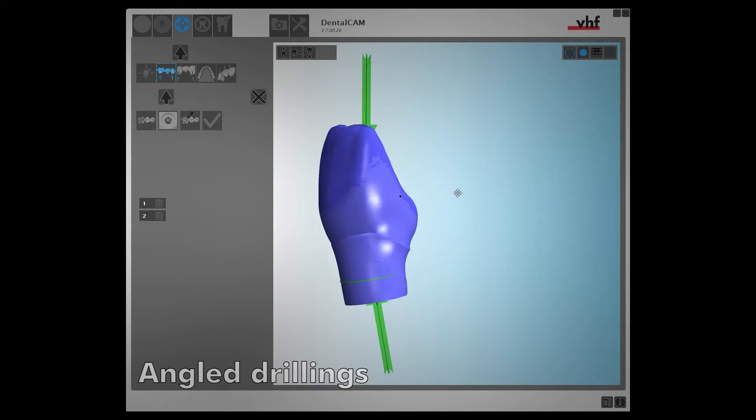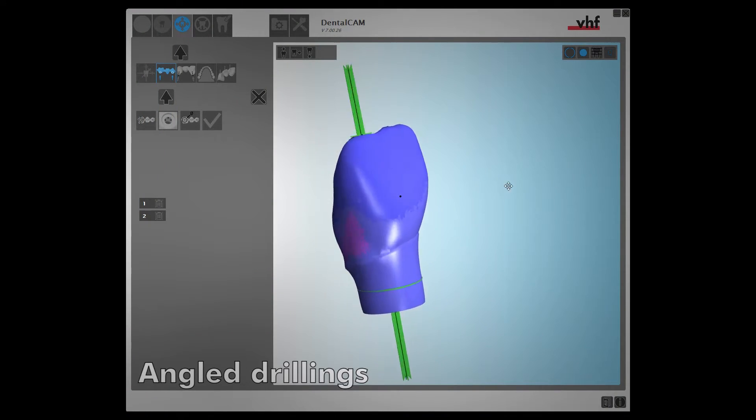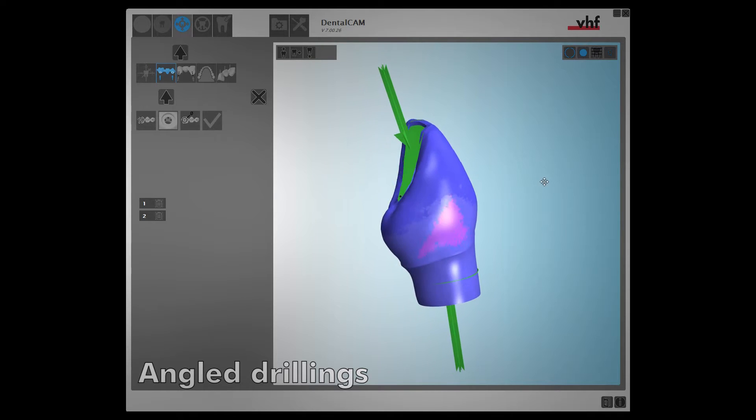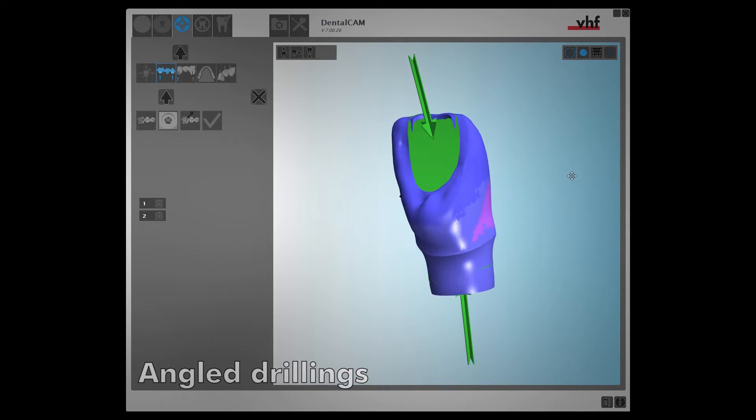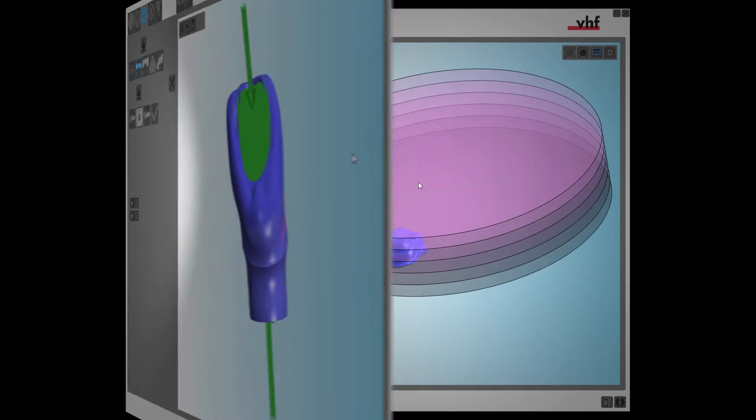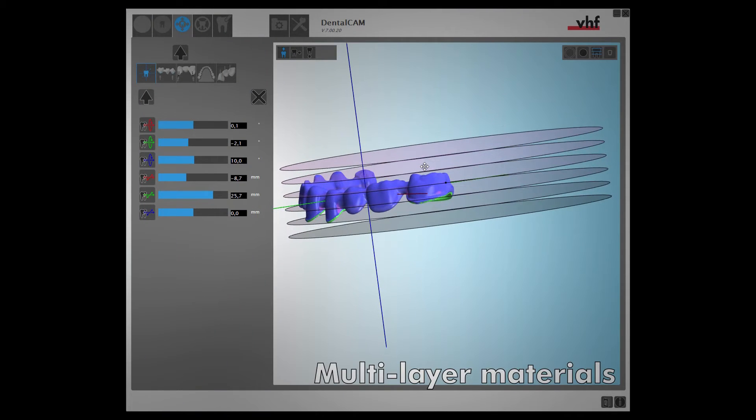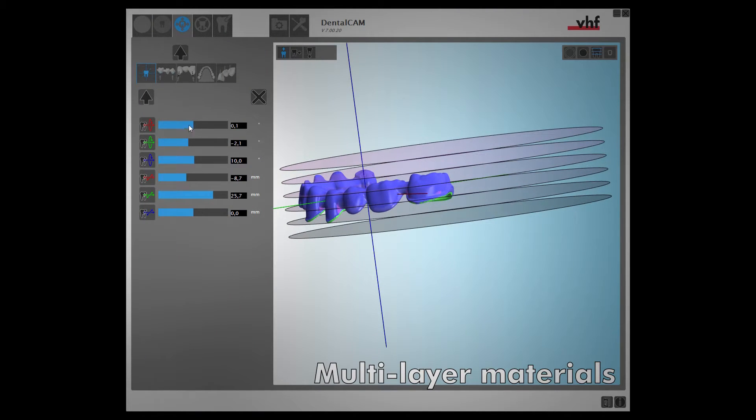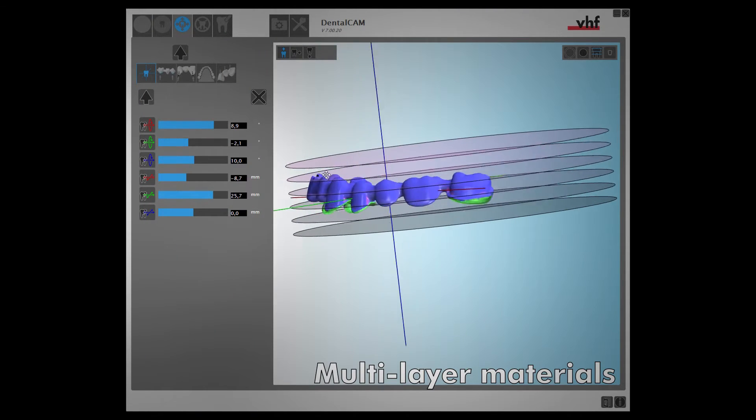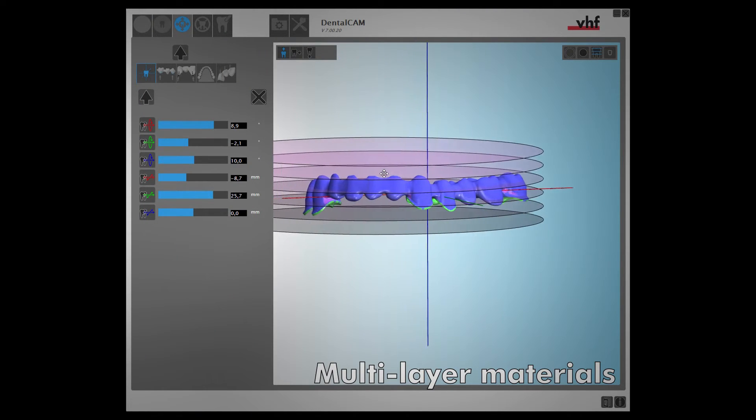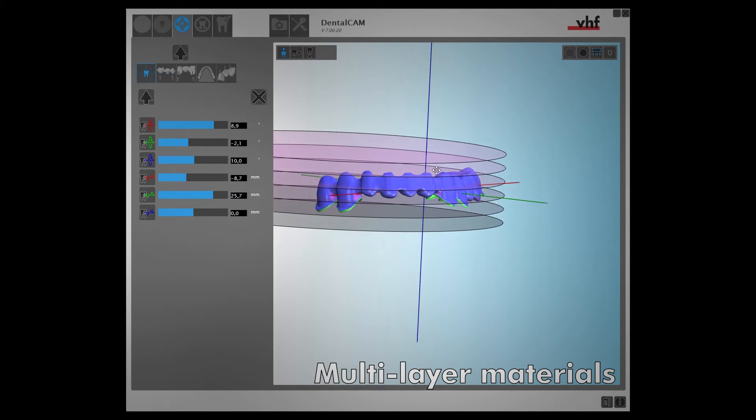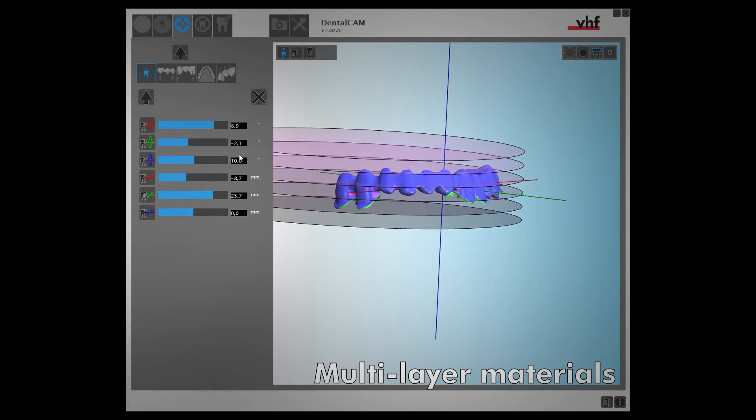DENTAL CAM 7 also enables you to work with angled drillings. Now, it is easy to check the positionings of objects nested in multi-layer materials, and also make precise adjustments.